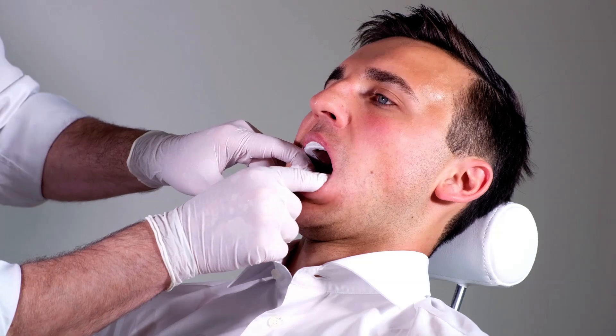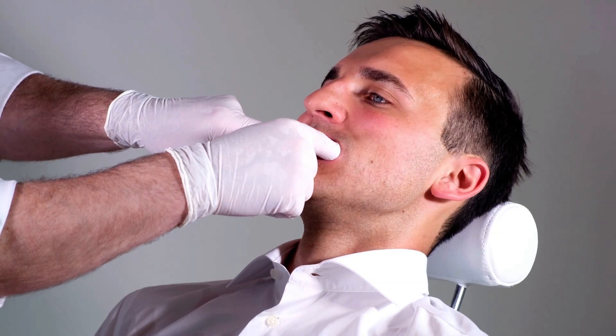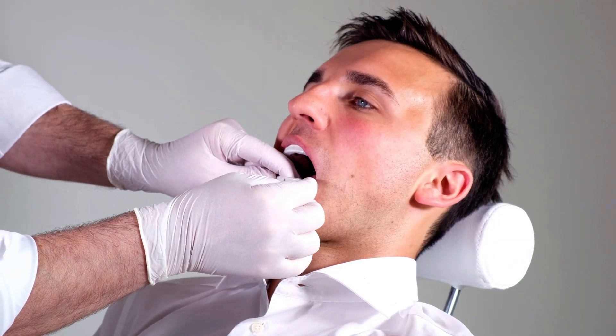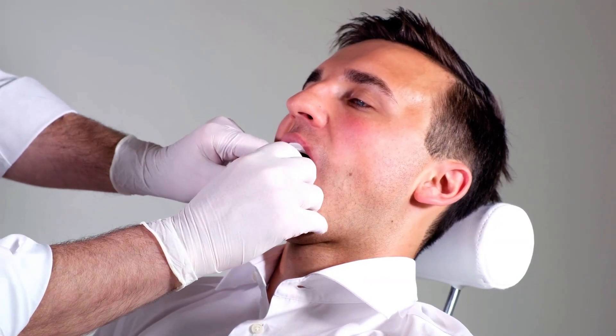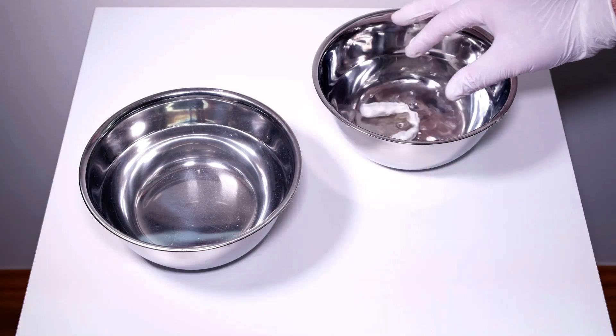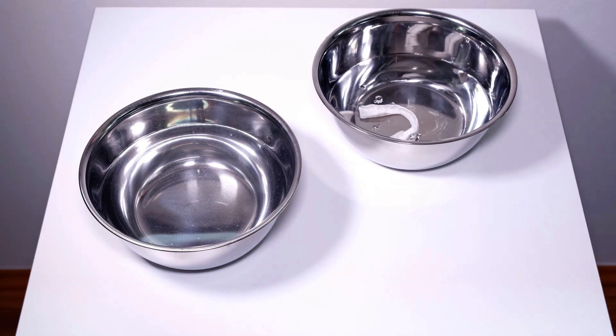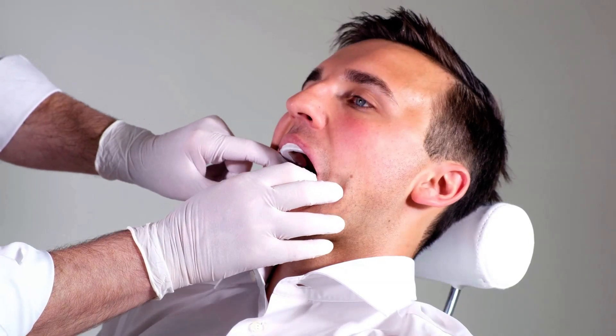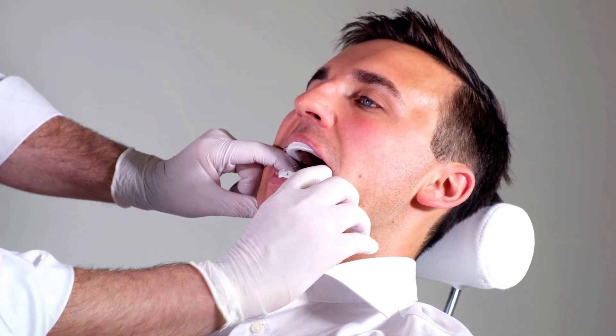Ask the patient to make sure that the tongue doesn't move the inner wall of the tray upwards. Grab the fixation knobs to vertically and carefully remove the tray from the mouth. Let the tray cool down in a bowl filled with cold water for about 20 seconds to harden the material. Place the lower tray on the teeth and check its fit. If it's not perfect, the fitting process can be repeated.